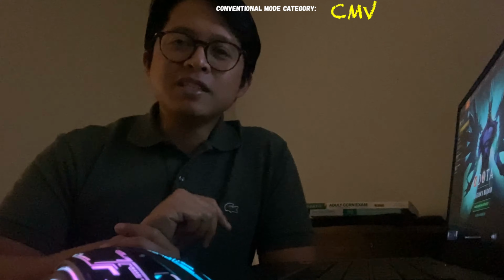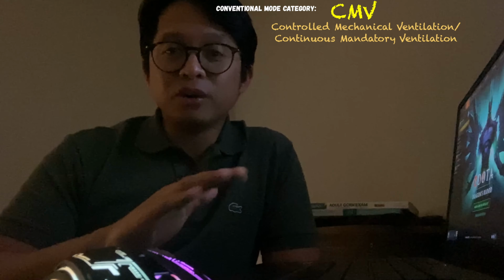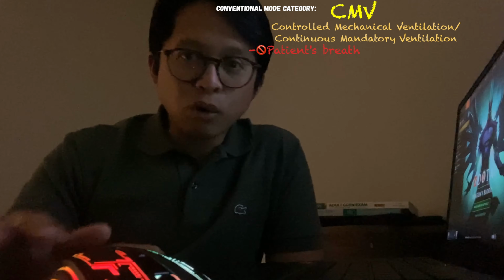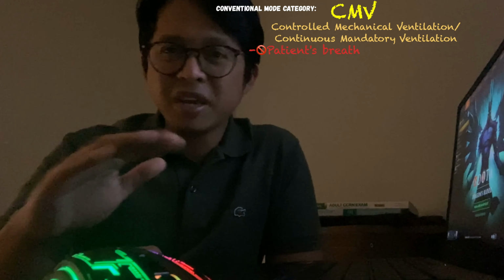Okay, I'll explain first the mandatory ventilation mode, and that mode is the CMV, controlled mechanical ventilation or continuous mandatory ventilation. This is a mode where the patient is not allowed to breathe on his or her own. The breaths in this mode are all from the ventilator, none from the patient.